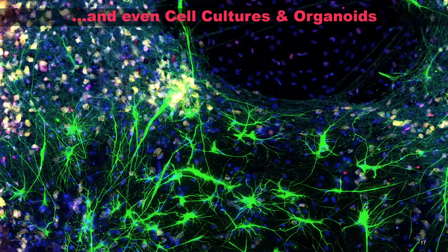Now I just ask you to imagine, okay, I've done IHC with 3 markers for much of my career. What am I going to do with 42 markers? What am I going to ask? What question am I going to ask? How am I going to phenotype my cells? How many cells are there? Where are they? How are they interacting with each other? These are questions that we ask with CODEX.